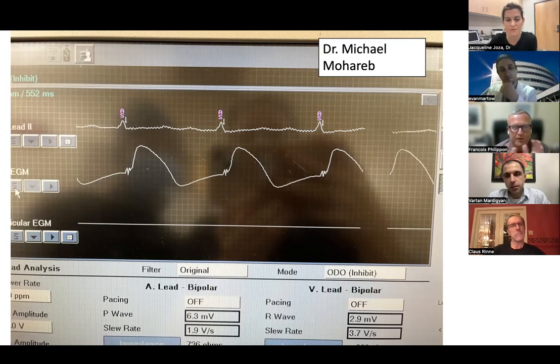Yeah, just for the final couple of screws, you ask yourself, am I going to give a little bonus or not? And sometimes I screw up when I do a couple of bonus turns. Yeah, no, you see that QS is really terrible.